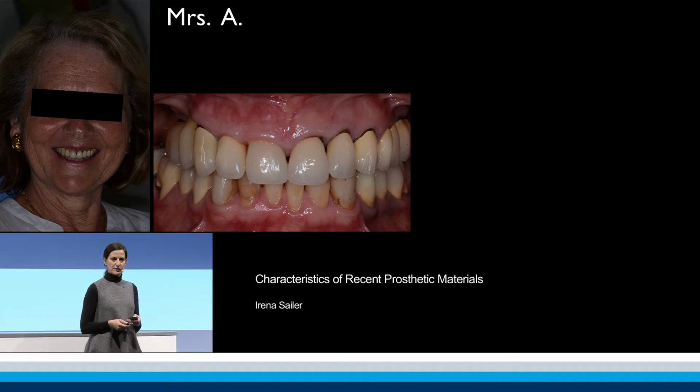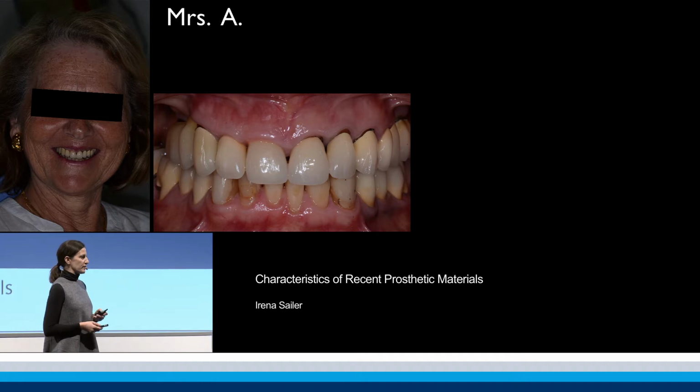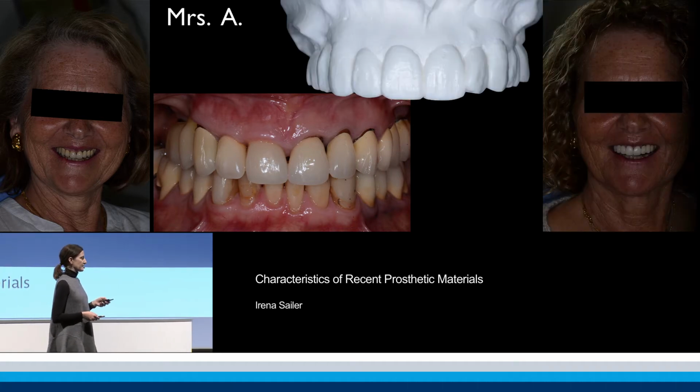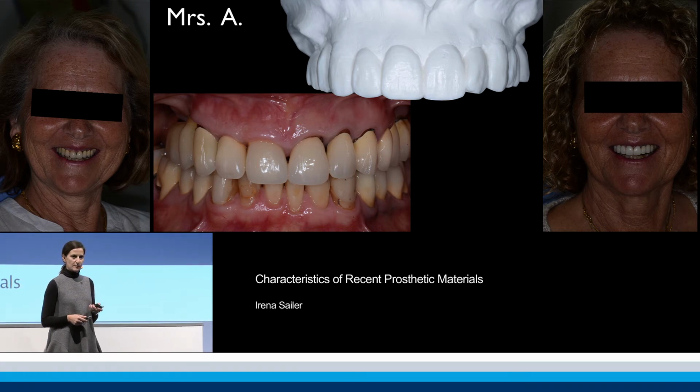you would examine her, you would include radiologic examinations, you would go through a period of dividing the teeth into safe, doubtful, or questionable, or irrational to treat, and then you will complete this first treatment phase with a diagnostic wax-up. Conventional wax-up done by the laboratory according to the needs or the desires of the patient, and then transferred into the clinical situation by means of a mock-up.